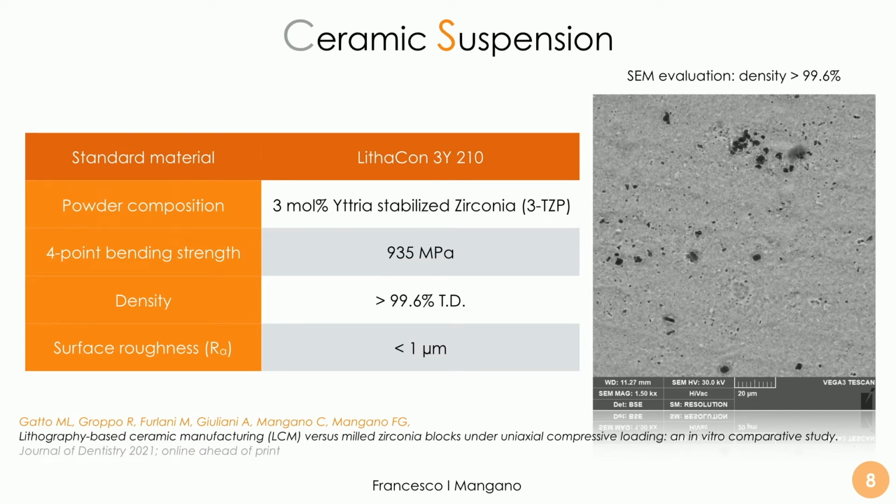And here the characteristic of this ceramic suspension. If we watch the scanning electron microscopy, we see the layers and we see the density. The density can be over 99.6%, and it is very promising from this point of view.